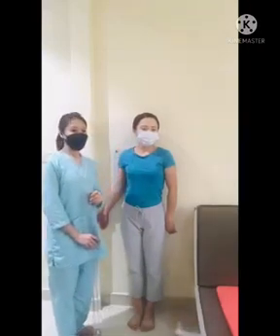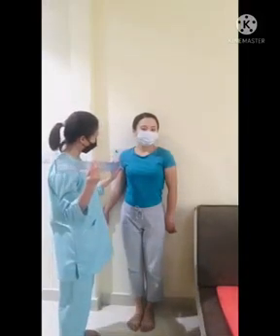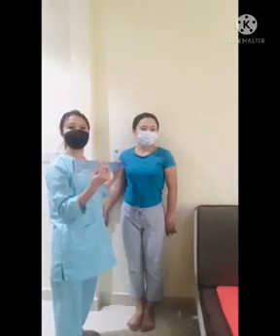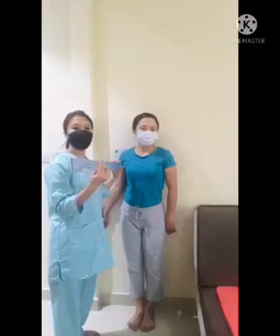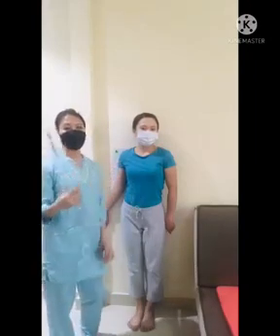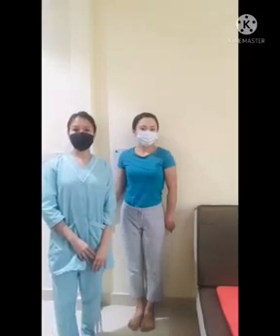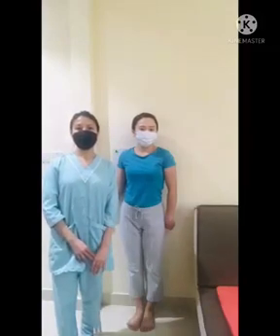So the central ray in this projection is perpendicularly directed 1 inch distal to the coracoid process. The projection demonstrates the true AP of the shoulder, the greater tubercle of the proximal humerus, and the site of insertion of the supraspinatus. Next is the AP neutral rotation.